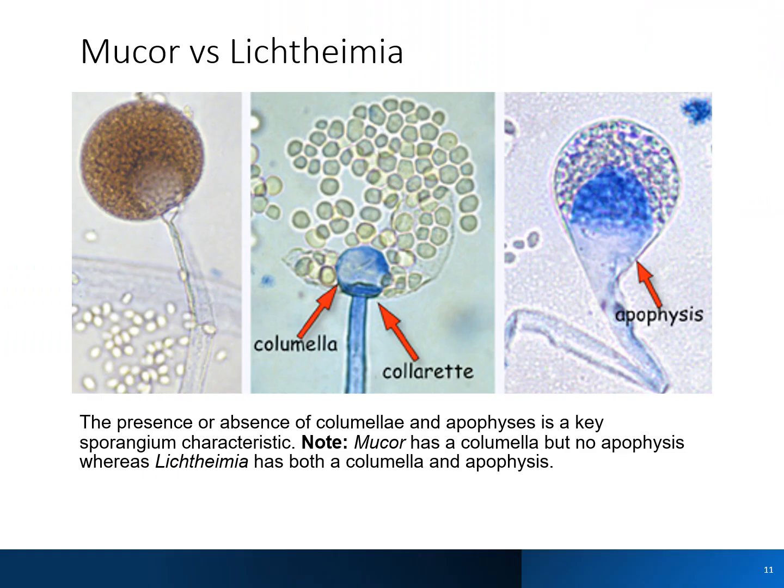When comparing the Mucor with the Lichtheimia, the Mucor does not have that swelling at the end of the sporangiophore. So you can see here in these two pictures where it just runs straight up until it hits the columella, whereas the Lichtheimia has that swelling.